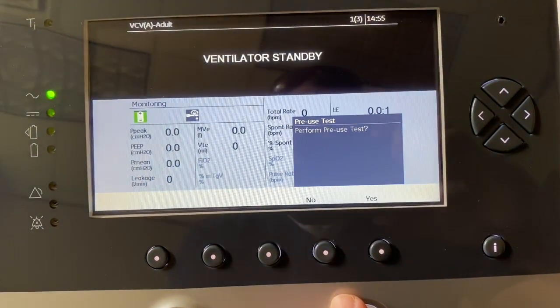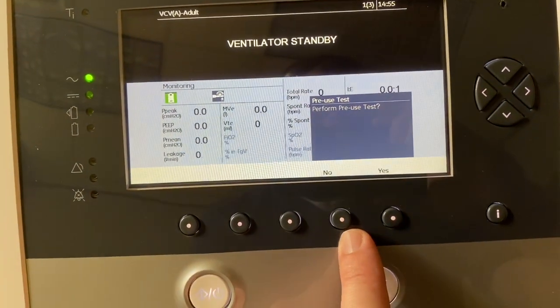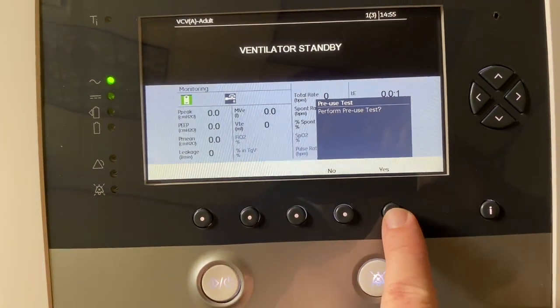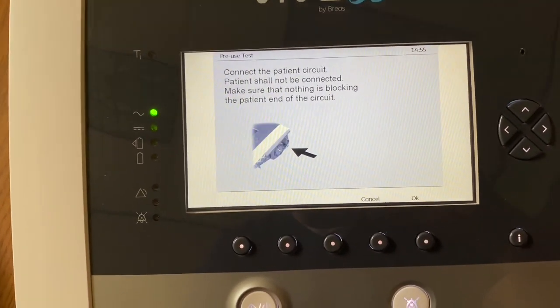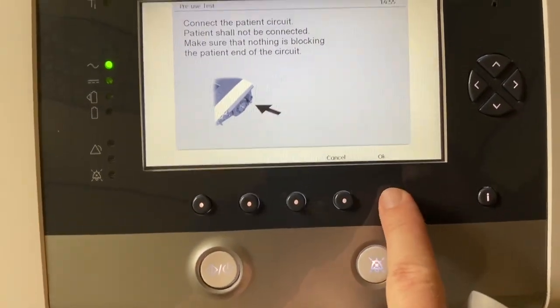You see the pre-use test — it's asking you to perform a pre-use test. Anytime it's the first time setting up a patient, or if you're changing out a circuit, you're going to want to do a pre-use test. It guides you through how to do the test. Right now it's telling you to connect the patient circuit, do not connect the patient, and make sure nothing is blocking the end. Exactly how I have it right now, so I'll hit OK.